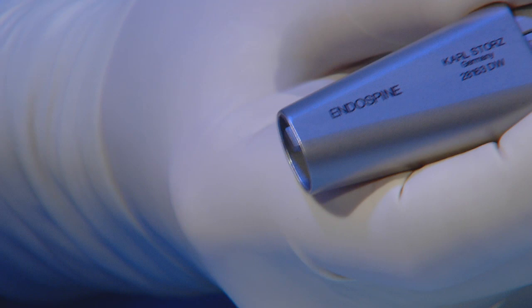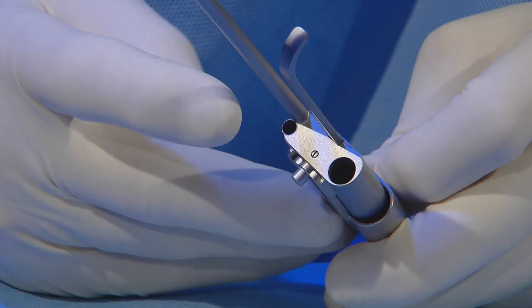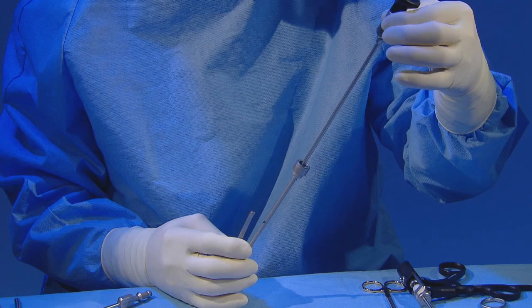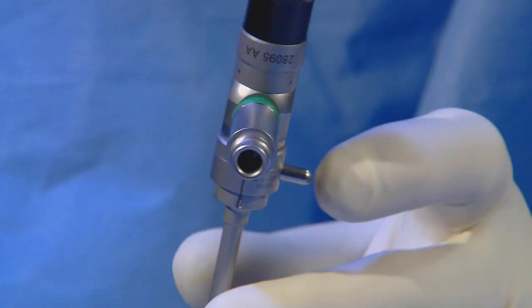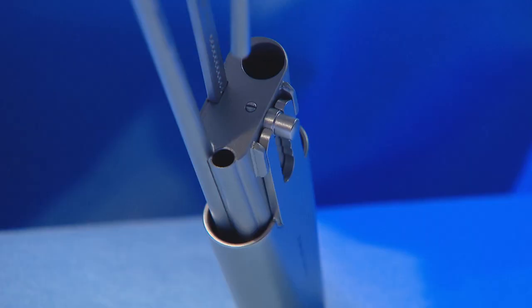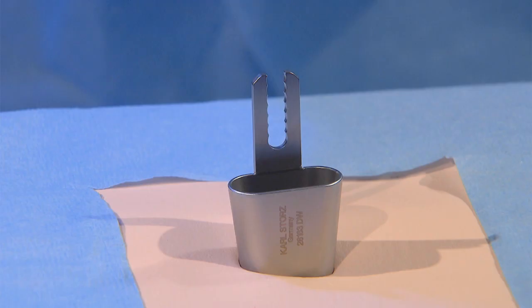The endospine system consists of three working channels. One is for the telescope, which has a 4 mm diameter, 0-degree direct view endoscope. The second is for suction, and the third and widest is for the surgical instruments.